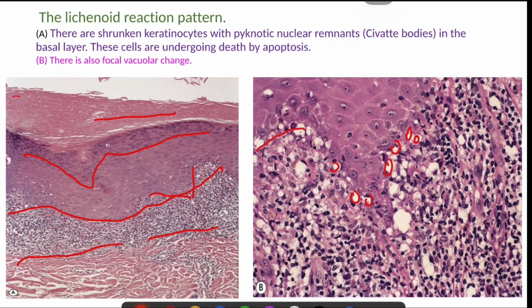And yes, colloid bodies, which you can identify having a pink colored appearance here.